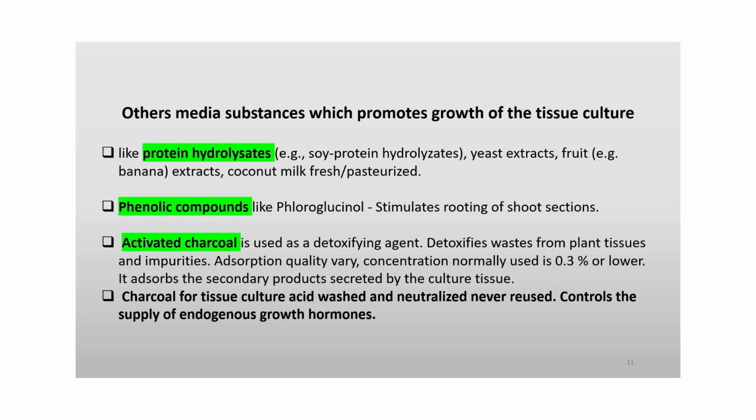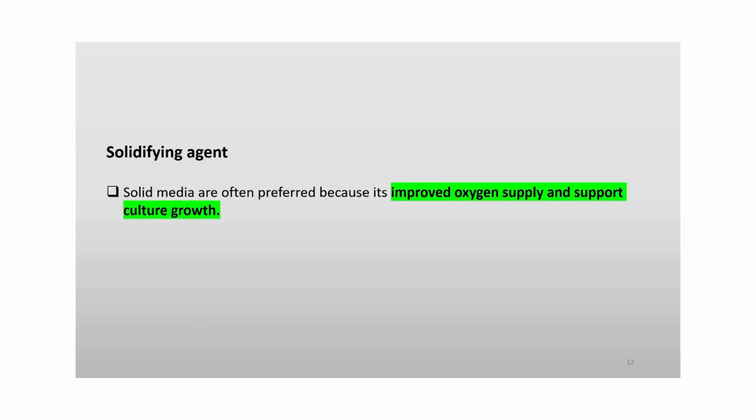controls the supply of endogenous growth hormones. Demineralized water can also be used. Solidification agent: solid media are often preferred because it improves oxygen supply and supports culture growth. Therefore, a substance with strong gelling capacity is added into the liquid media.